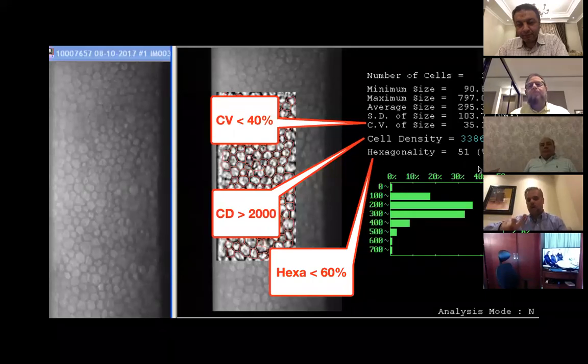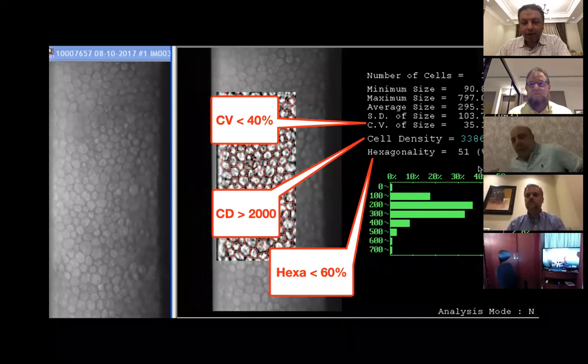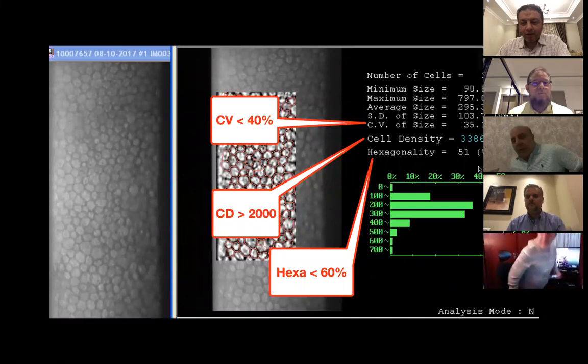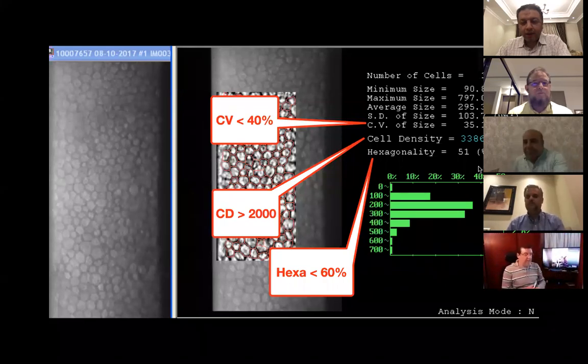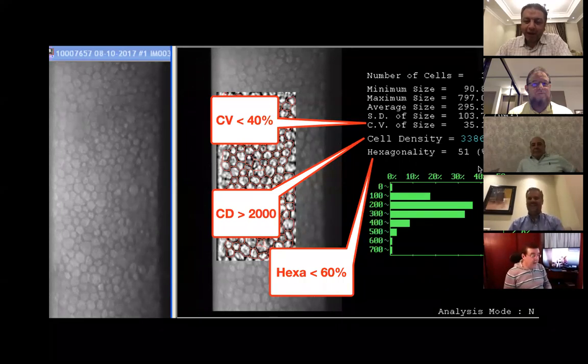Do you return the ICL inside the eye, or do you take it out and reinsert it a second time? You extracted it and then re-implanted it. Yes. Okay. Actually, I would prefer to get the lens out, reload the lens, and re-inject again. Actually, I got it just once, and they found it with the OCT anterior segment, and I inverted it inside the anterior chamber, but fortunately it's well until now. But I know that it's a risky, dangerous movement.